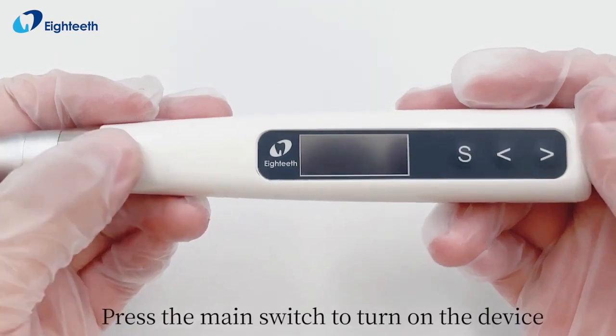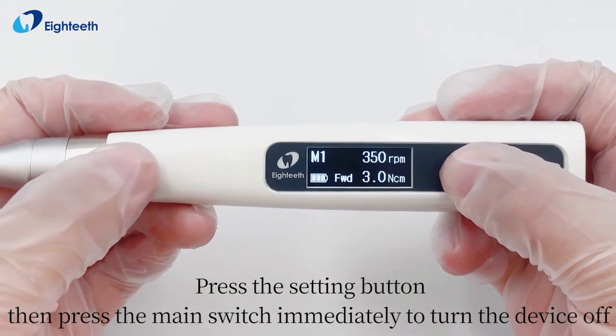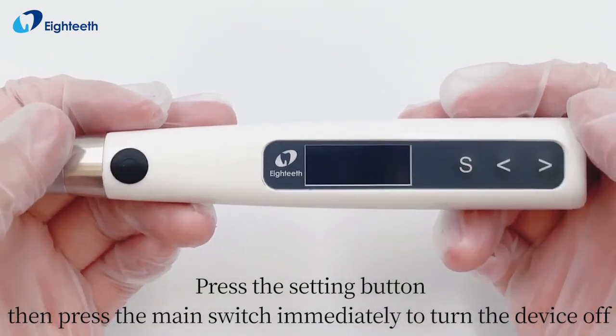Press the main switch to turn on the device. To turn the device off, press the setting button then press the main switch immediately.